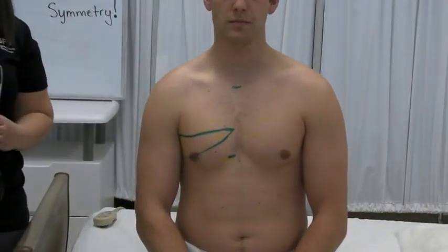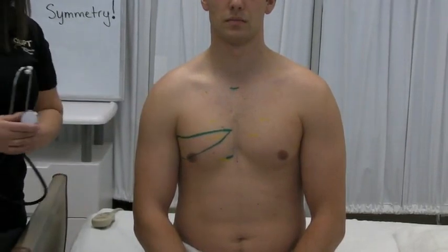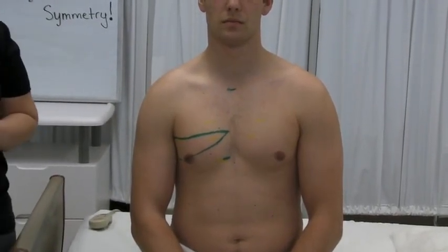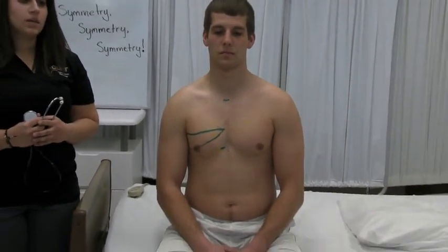As you listen to your patient's breath sounds, you will notice a change in the sound. Higher up over the main stem bronchus in this area, or in the back right between the scapulas, you will hear a much louder sound. Then as you go down over the regular lung field, the sound will be softer. This ends the portion on auscultating the patient.